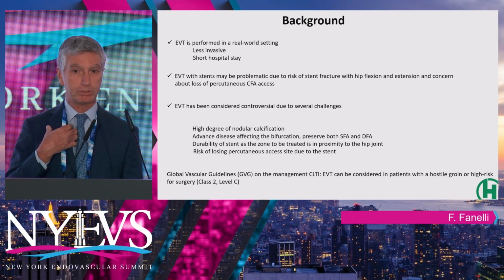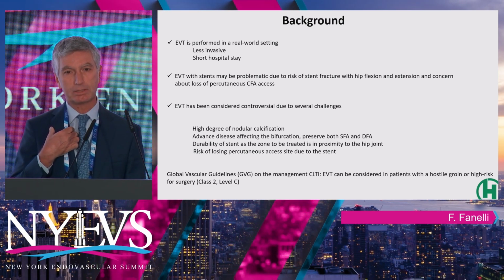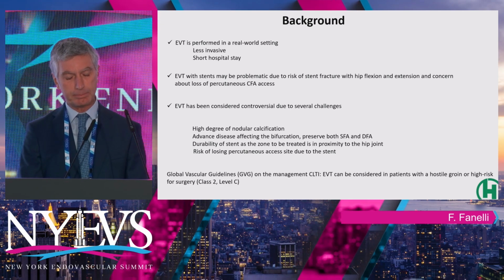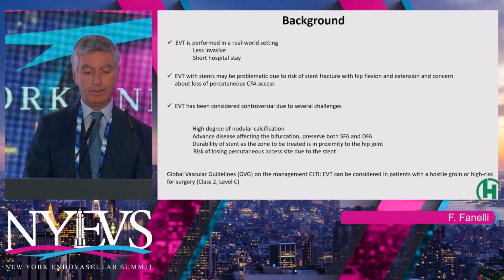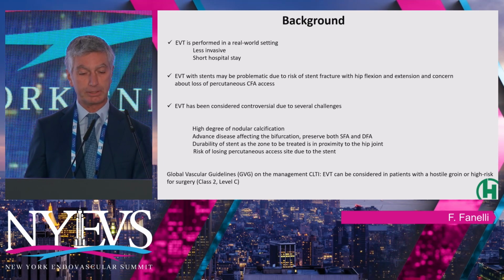First of all, the huge amount of calcium we see right now from the case from Leipzig. And also there are some concerns regarding the use of stents in this area, because this can compromise the flexibility of the vessel and the patency of the stent, but also we can lose an access, because this is something that we have to consider, especially in case of young patients.